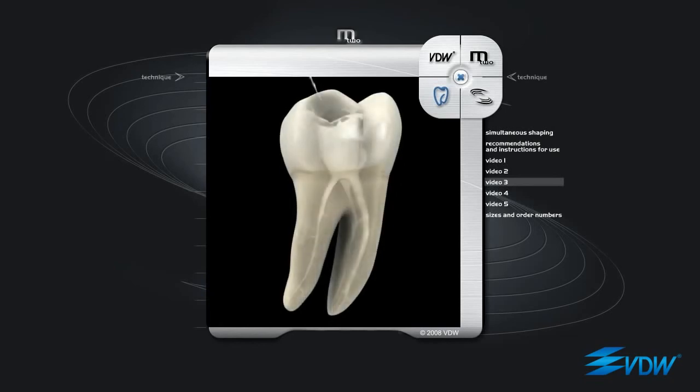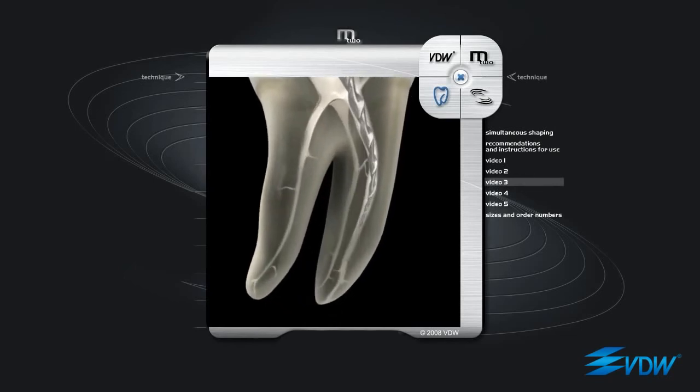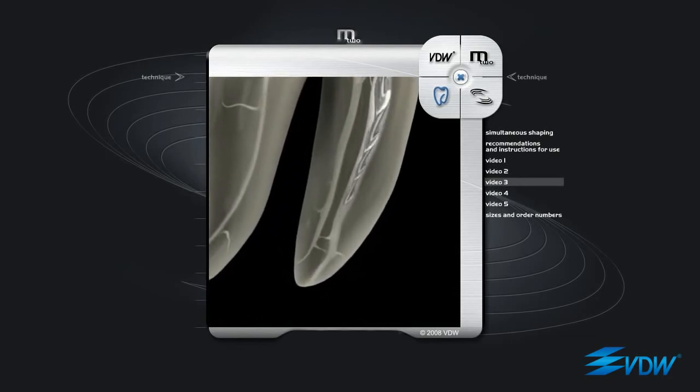Even with the third instrument in the sequence, there is an increase in both tip diameter and taper. This is an ISO 20, taper 06. It is inserted into the path made by the previous instruments. Here, filing is required only when the tip is a few millimeters from the apex.